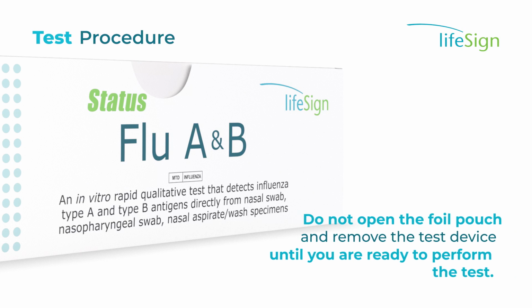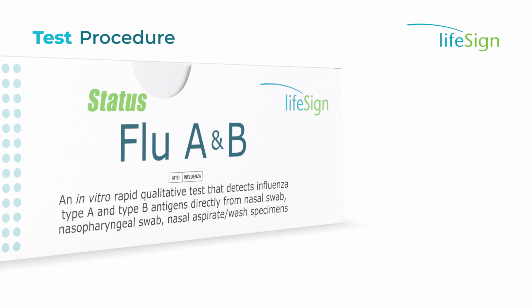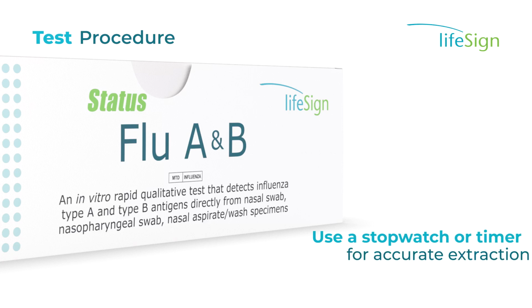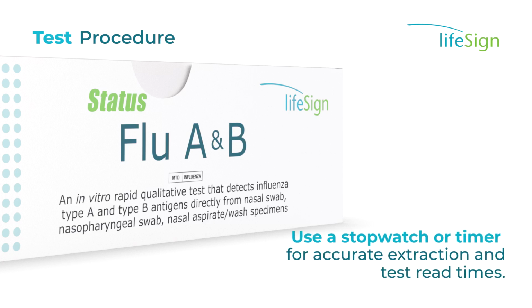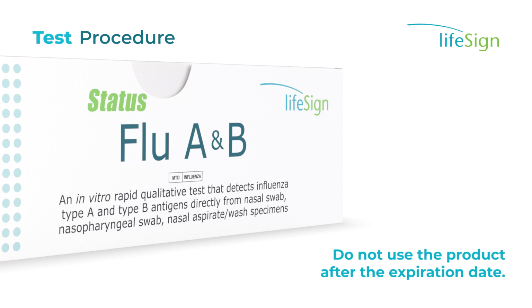Do not open the foil pouch and remove the test device until you are ready to perform the test. Freshly collected specimens should be tested immediately for best results. Use a stopwatch or timer for accurate extraction and test read times. Do not use the product after the expiration date.